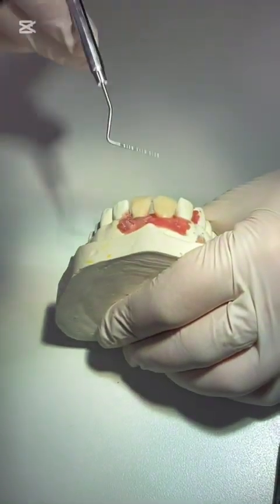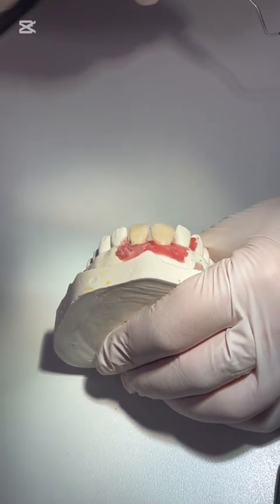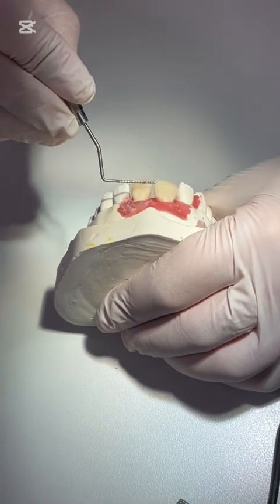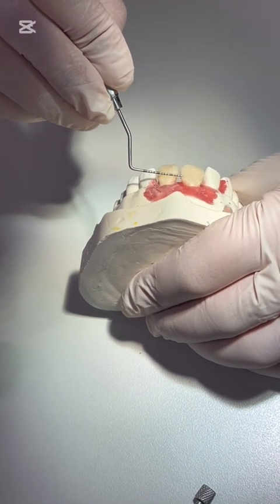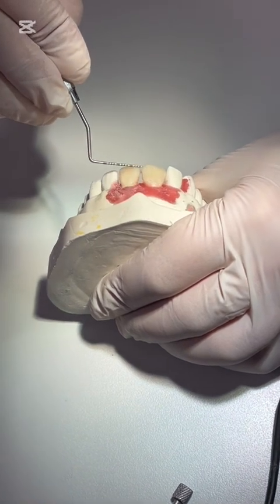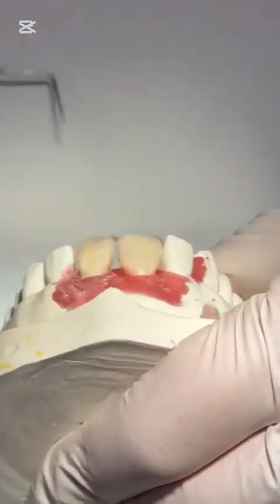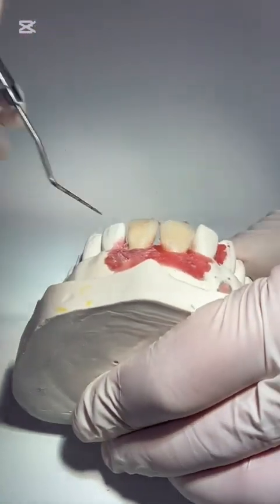So first of all, I have to think that I should make the two teeth similar to each other. And I should check the space between the teeth. Here, the space between the teeth is 3 millimeters at this side and 1 millimeter at the incisal edge. And I have little space between the central and lateral.